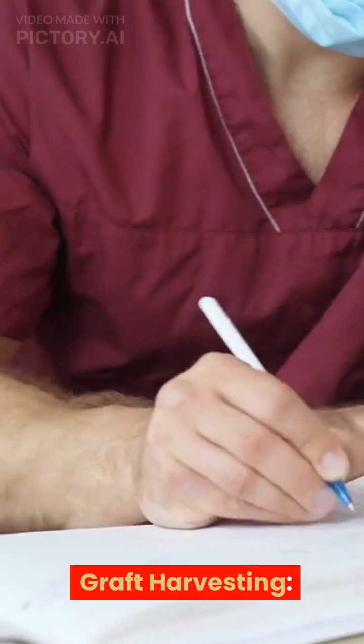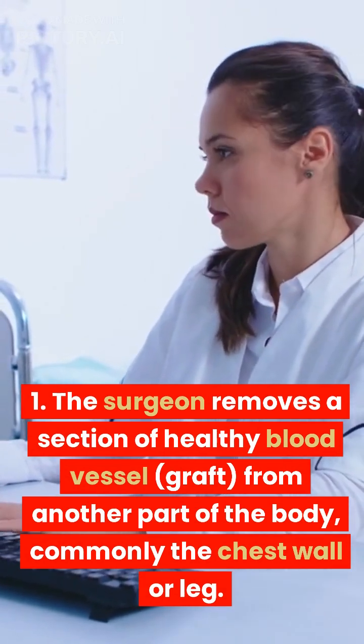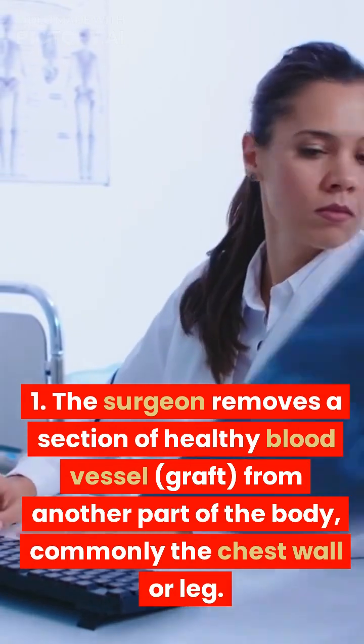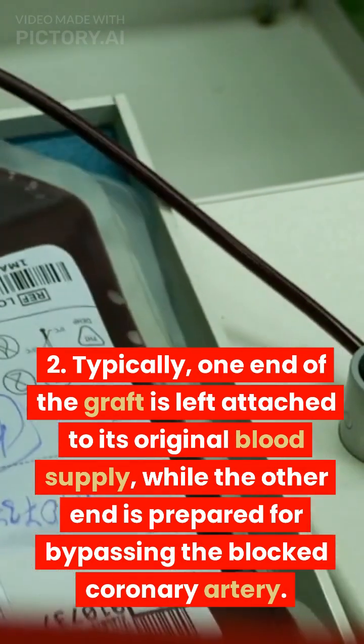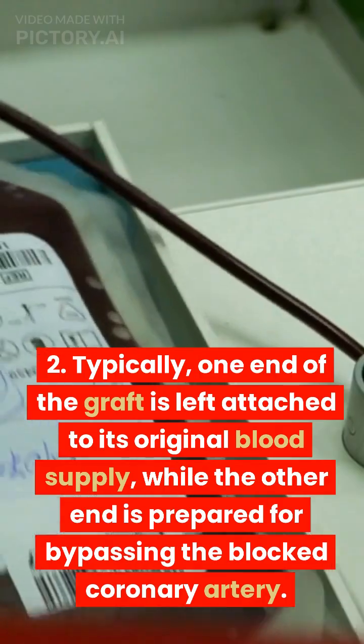Graft harvesting. 1. The surgeon removes a section of healthy blood vessel, graft, from another part of the body, commonly the chest wall or leg. 2. Typically, one end of the graft is left attached to its original blood supply, while the other end is prepared for bypassing the blocked coronary artery.